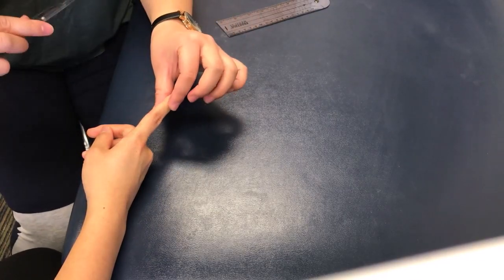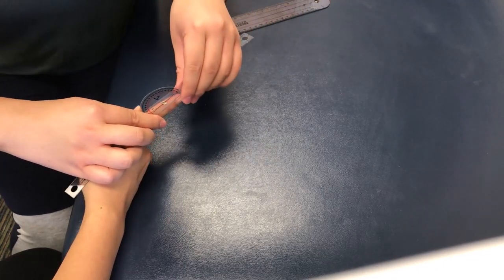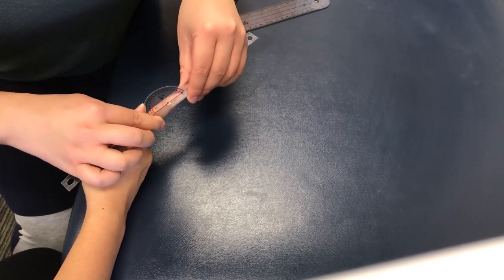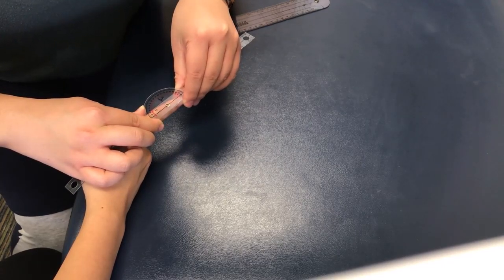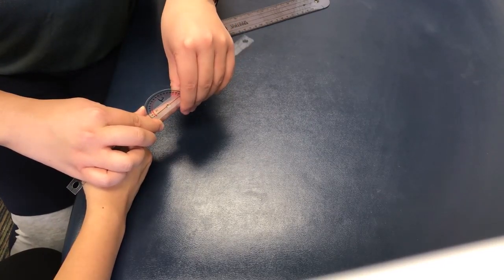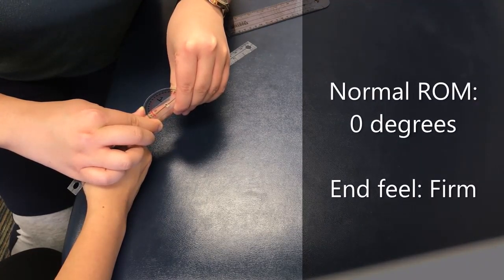For DIP extension, the landmarks are the same, so go ahead and place the goniometer, and go ahead and straighten your finger as much as you can. And it's right a little bit past 0, so about at 2 degrees, and then for passive, I'm going to just push in the end range, and it gets to 5 degrees.